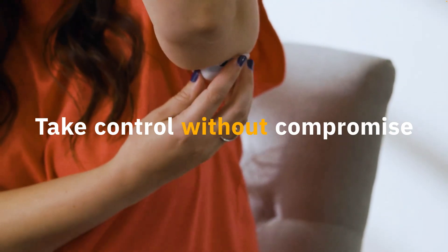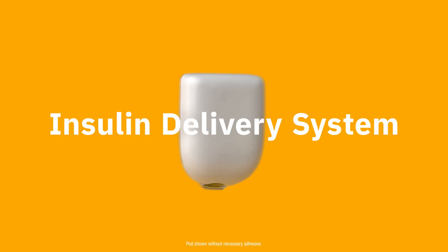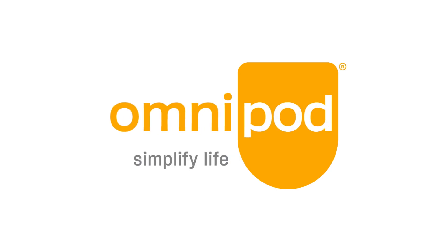Take control without compromise with the only tube-free, waterproof automated insulin delivery system that integrates with leading sensor brands. Simplify diabetes. Simplify life. Omnipod 5.